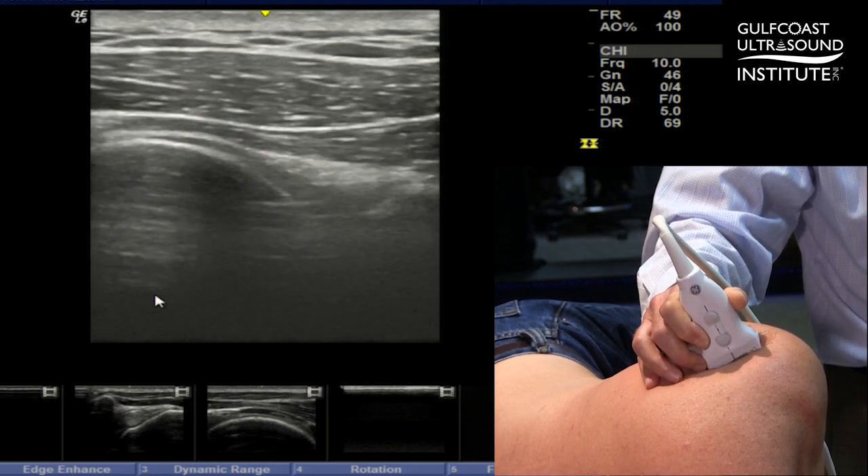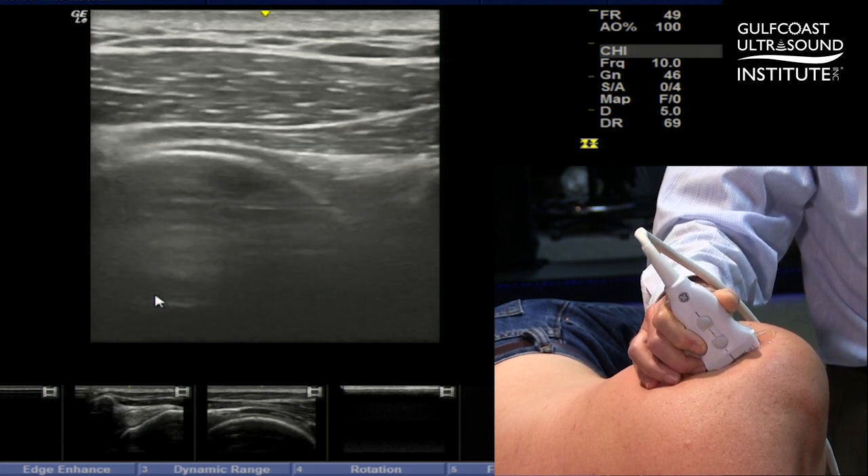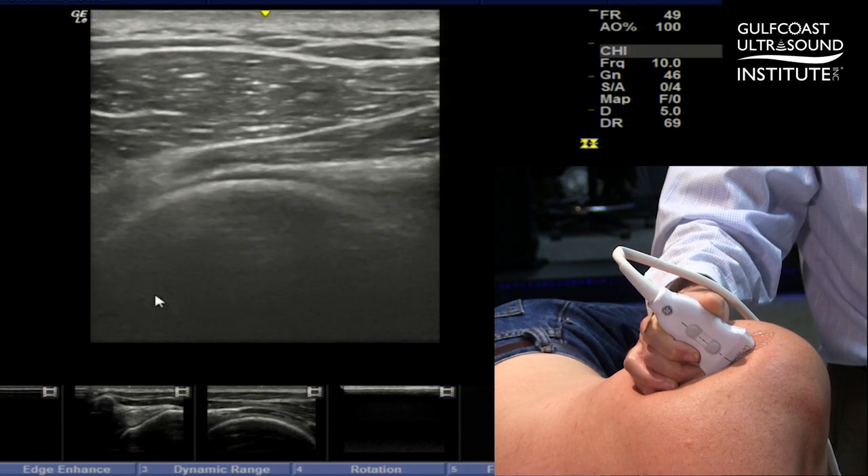I'm tilting the probe into the position where the sun rises, and then we get the sun to set out of the way of your injection by tilting the toe of the probe down more into the body.